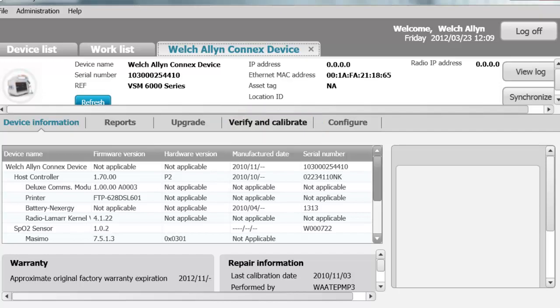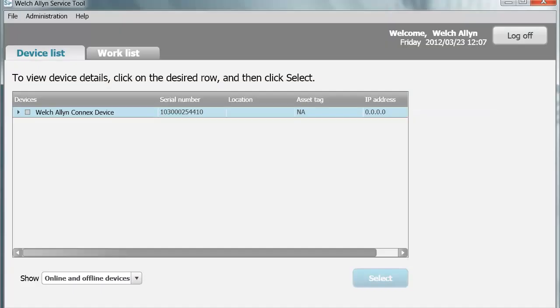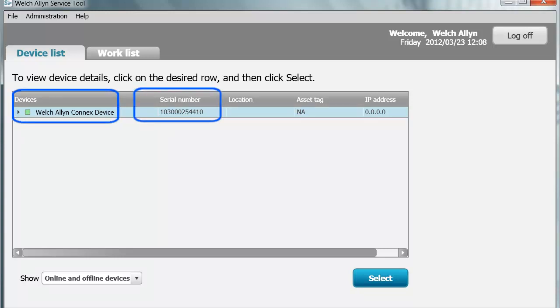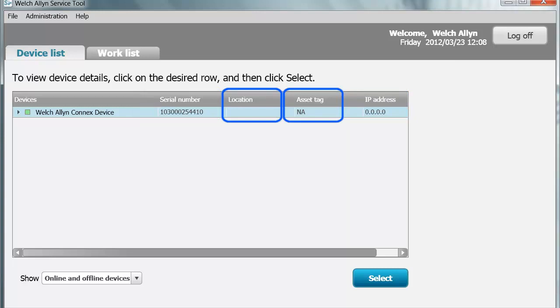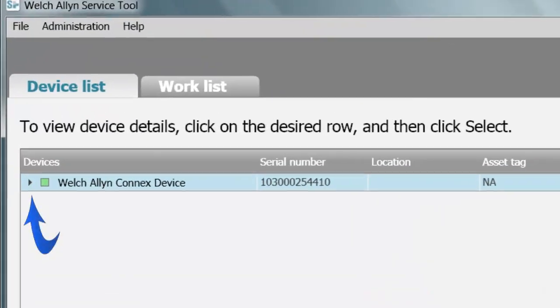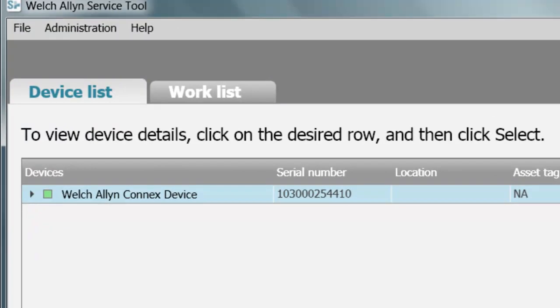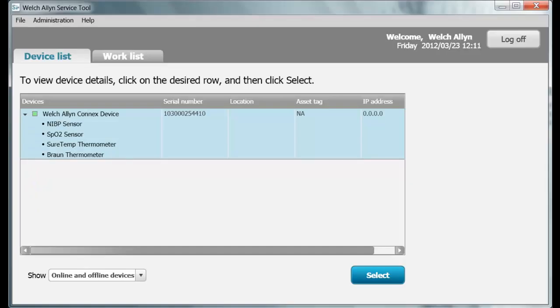I will demonstrate using the Gold Package. Connect your device to a PC with a USB-A to Mini-B cable. When you do this, you'll see the device show up in the Device List tab with a green box next to the device name, device serial number, device location, asset tag, and the IP address if applicable. The location and asset tag have not been set on this device, so those fields are blank. Click the small arrow to the left of the green box to expand the device contents. This device shows NIBP, SPO2, SureTemp, and Braun modules on board.